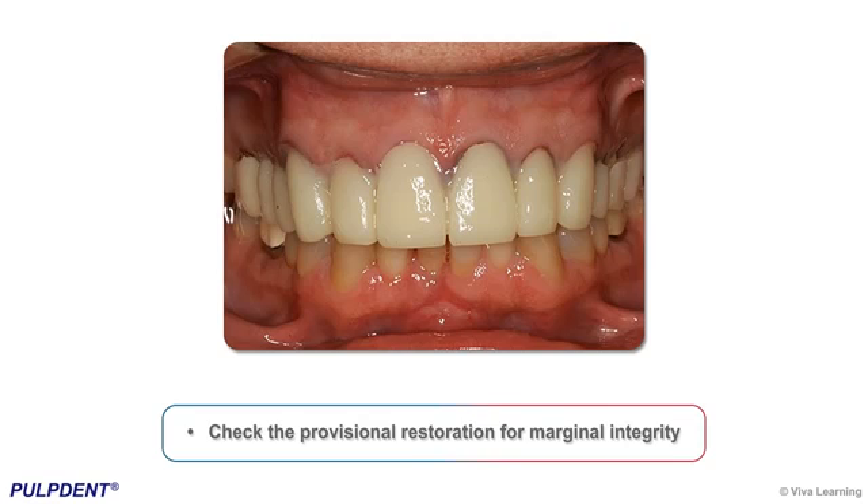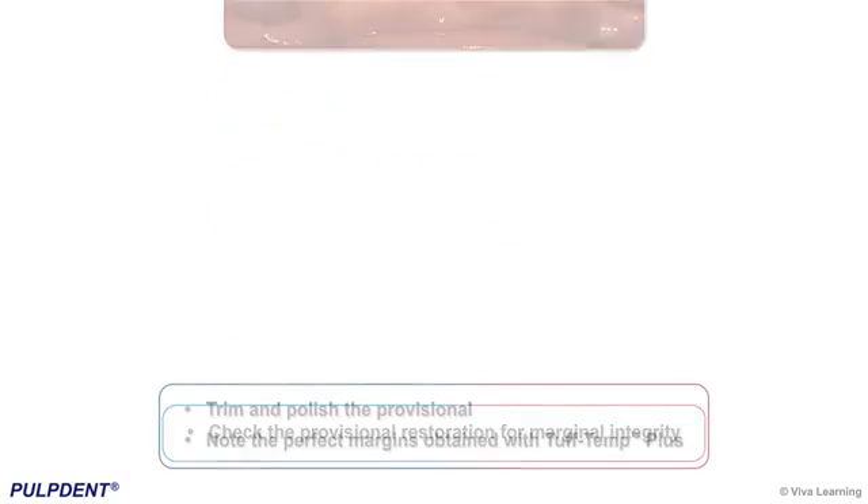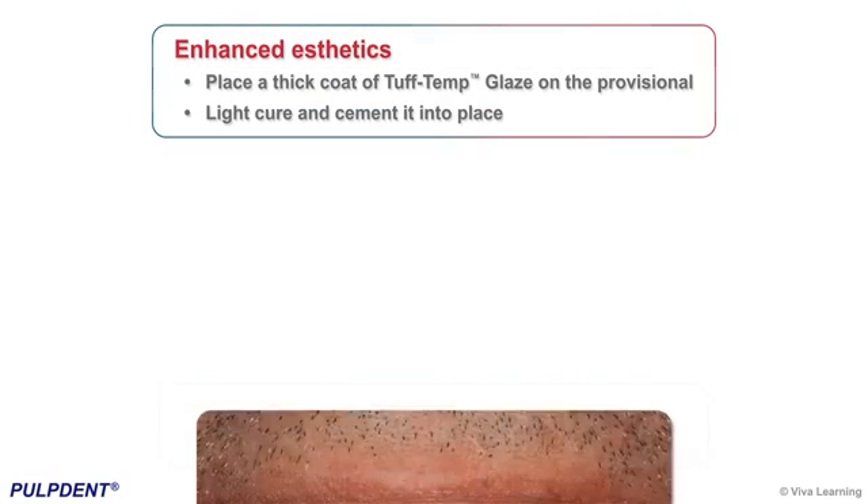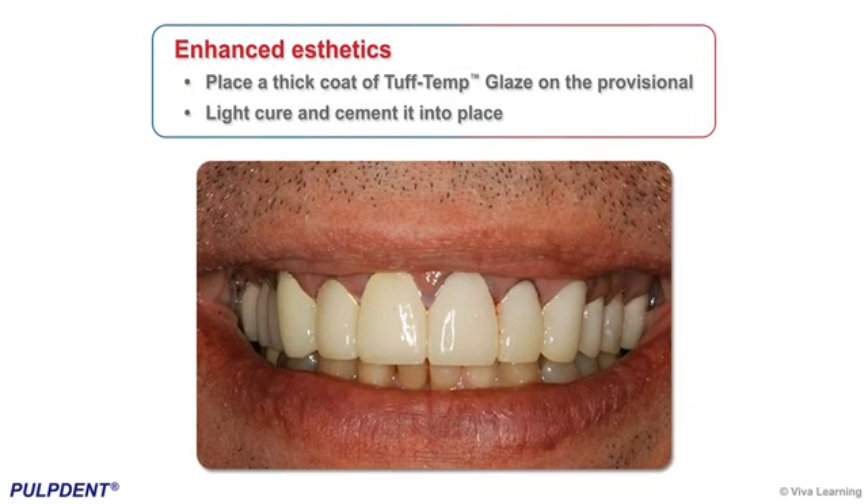Check the provisional restoration for marginal integrity. Trim and polish the provisional — note the perfect margins obtained with Tough Temp Plus. For enhanced aesthetics, place a thick coat of Tough Temp Glaze on the provisional, light-cure, and cement it into place. Note the exceptional margins and aesthetics.